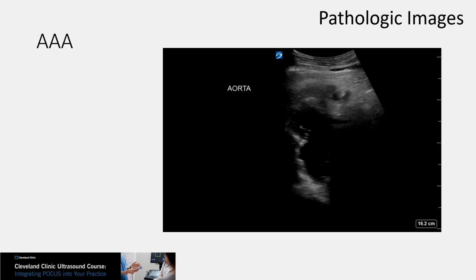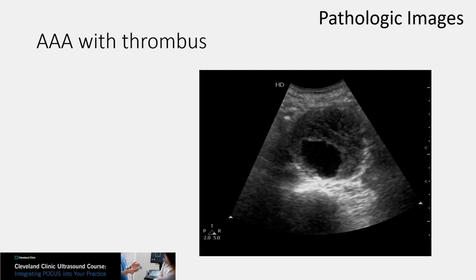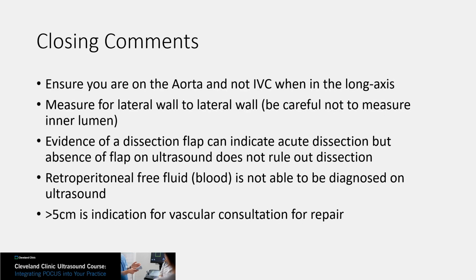Last but not least, here is an image of a AAA indicating an enlarged aorta. And here's an example of a AAA with a thrombus. Closing comments about this exam.